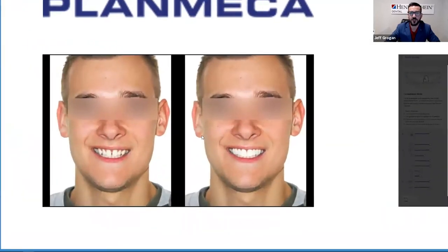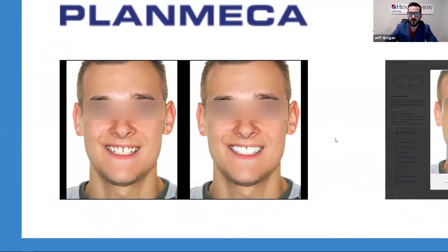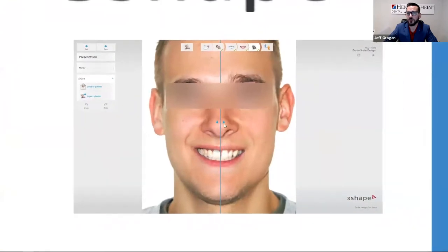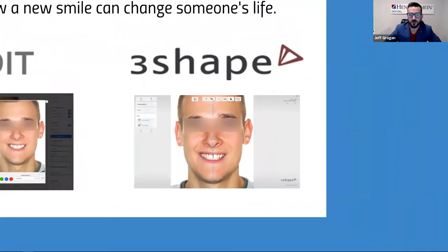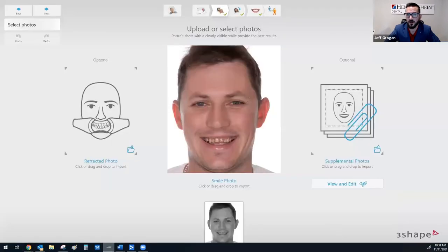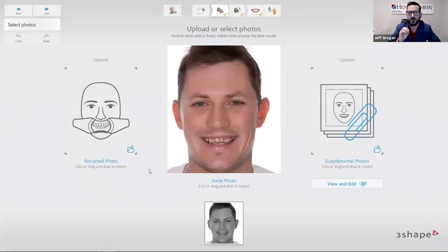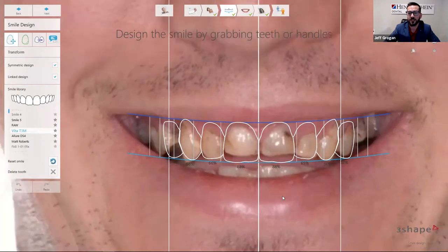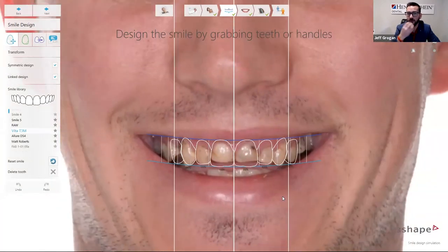You can see the different evaluation tools based on the same case out of Planmeca, out of Medit, and out of 3Shape. Let's take a deeper dive on 3Shape's smile design tools. Here in the smile design application, everything starts with a two-dimensional picture of your patient. As I move through the steps, it asks for landmarks — pupils, wings of the nose, corners of the mouth, and the visible lip line — so that when I put a template smile, it fits not only in perspective but with the visualization of the patient's face.